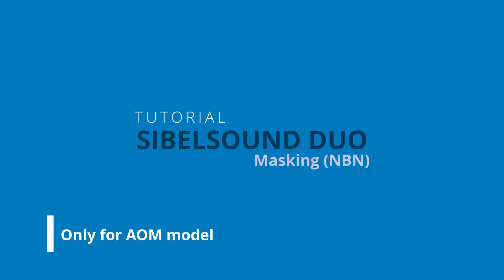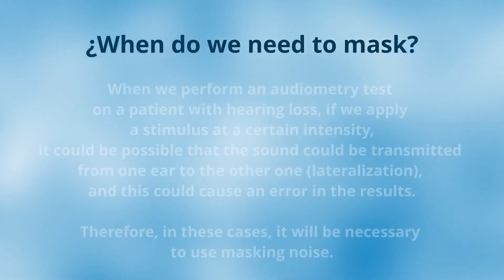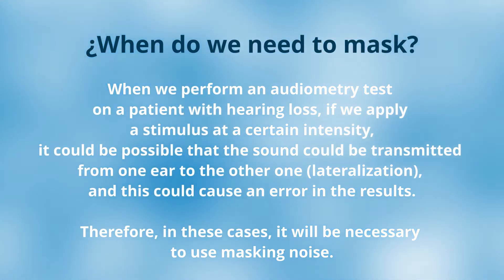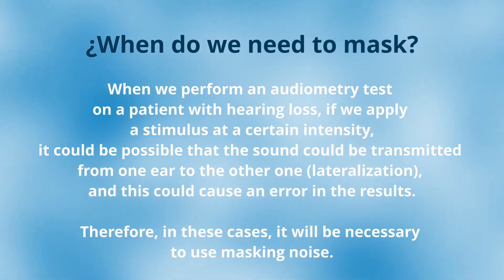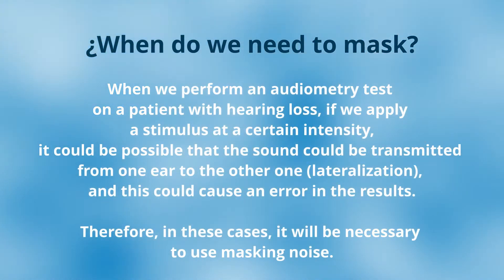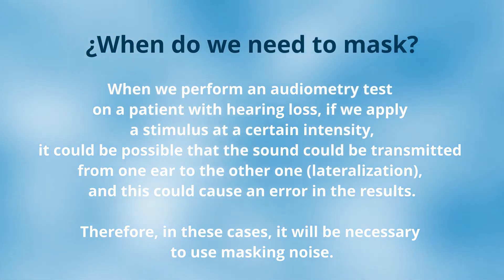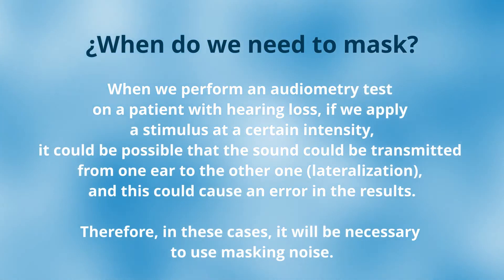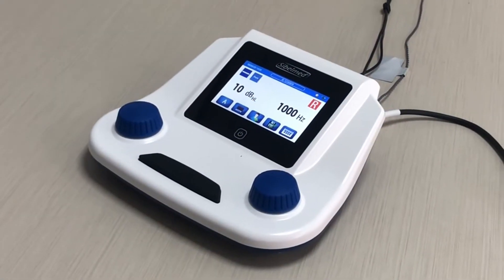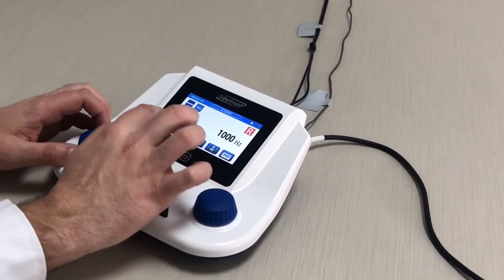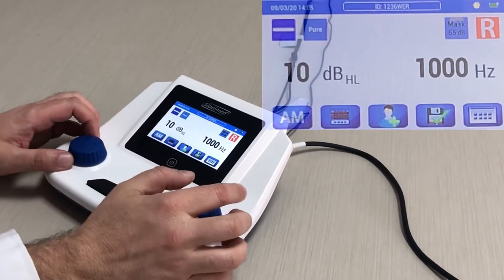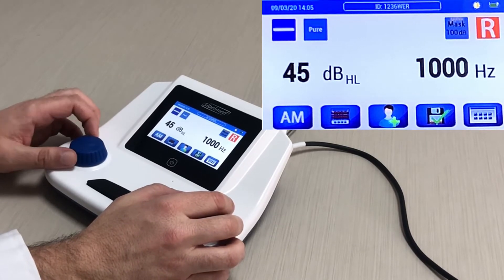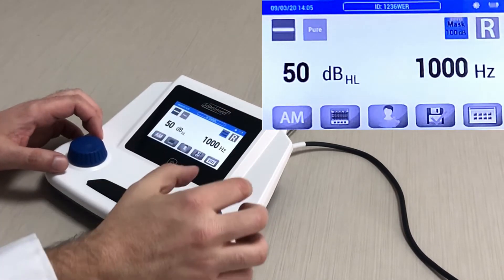Let's start a test using masking. When we perform an audiometry test on a patient with hearing loss, if we apply a stimulus at a certain intensity, it could be possible that the sound is transmitted from one ear to the other — this is called lateralization, and it could cause an error in the results. Therefore, in these cases it is necessary to use masking noise. First, we select the test with masking by the icon AM. We will see that the masking icon appears on the right side; clicking it allows us to modify its value.